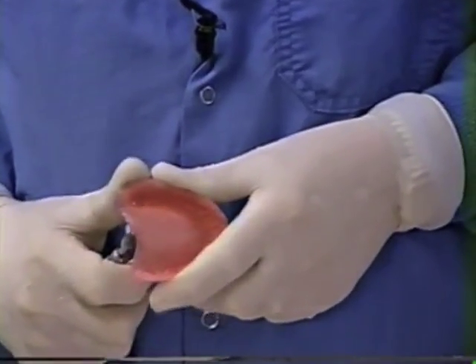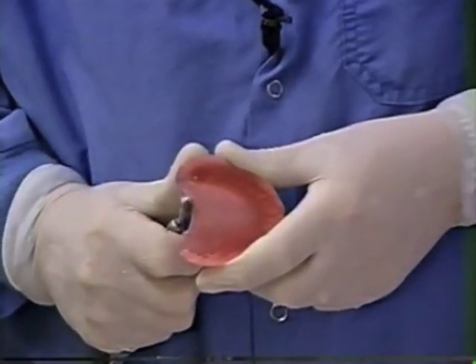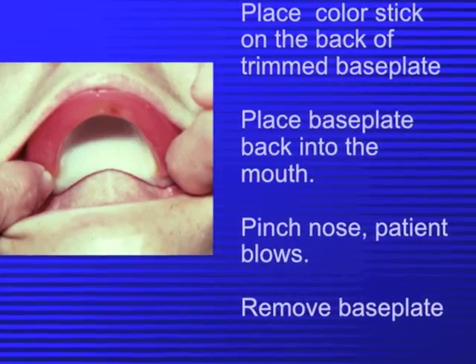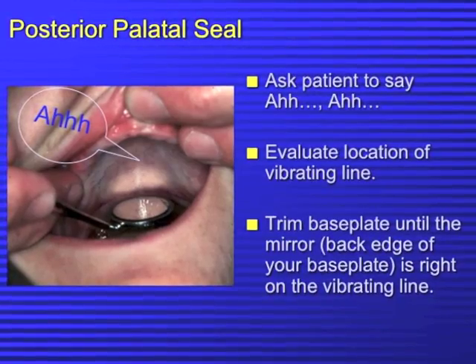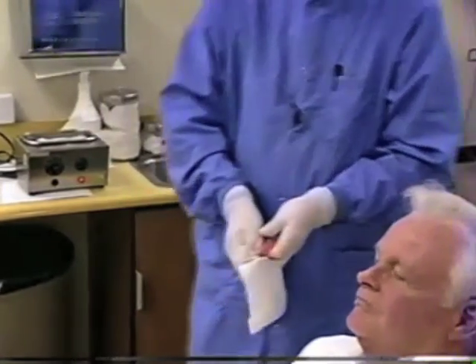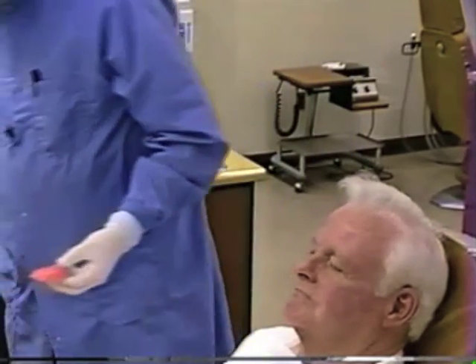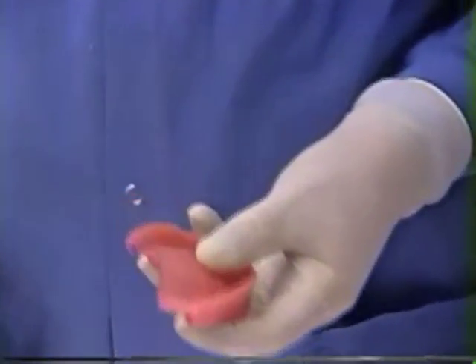So we're cutting it now to the length that we anticipated when we judged this in the mouth. Once you have that cut, we can rinse the chips off and dry it so we don't get a smear with the indelible ink. Take one of Dr. Thompson's sanitary markers and put the ink back onto the edge of it just like we did the first time. This is at the corrected length.